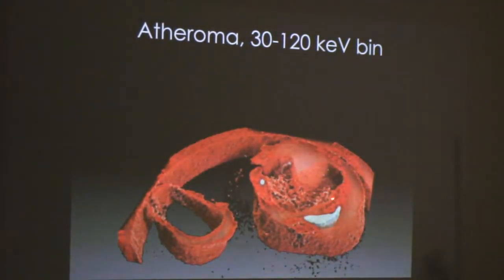And of course, when we get down here, you can see how this part of the artery is basically blocked. I think ultrasound results have confirmed this is something like 95% blockage. So there's really not much blood going towards the brain in this case.